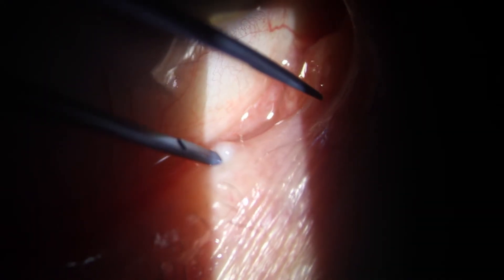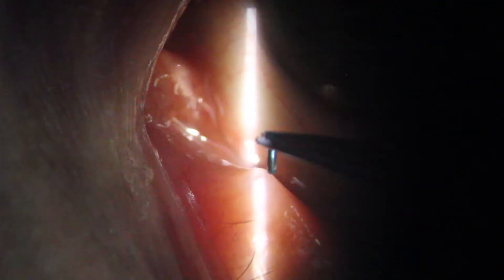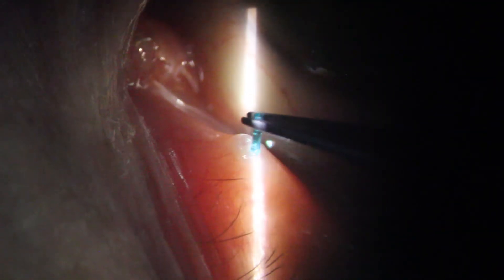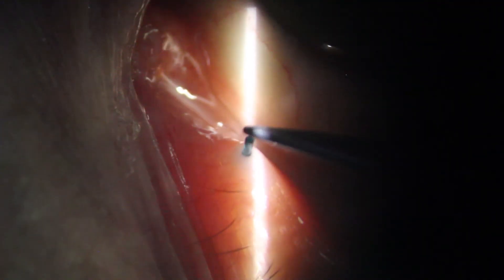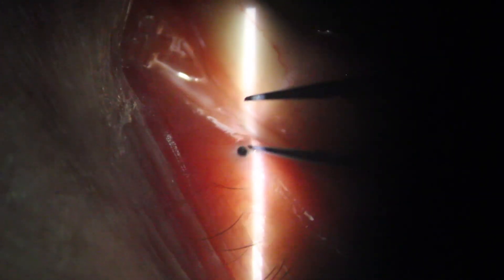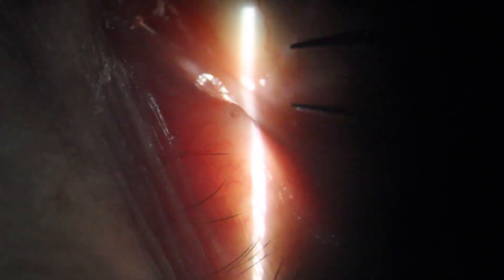It's very comfortable and very quick for patients. You'll see I put that lateral traction on the lower lid, put it into the punctum, and that lateral traction allows me to go around the corner. I push the plug a little bit along the canaliculus with the forceps. Here I'm doing it on the patient's left eye. The plug goes in — sometimes there's a small amount of pressure as that happens. I push it in a little bit and then use lateral traction to push it down along the canaliculus so that it sits there nicely.